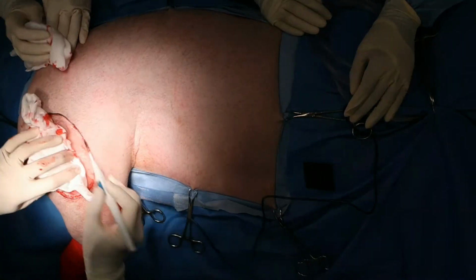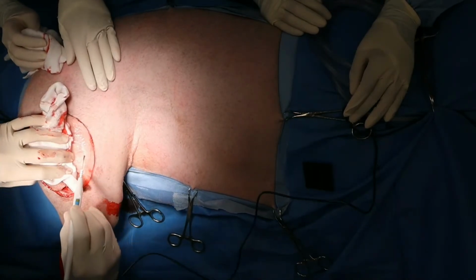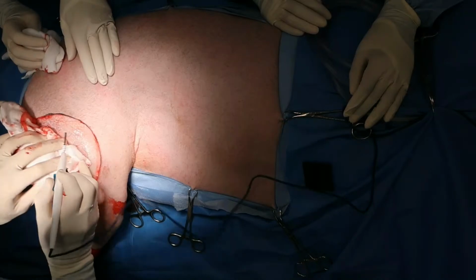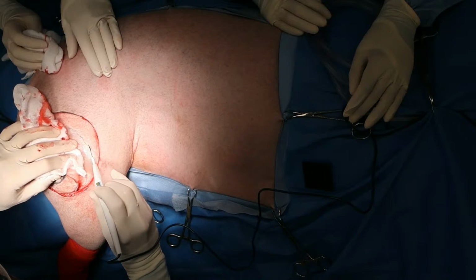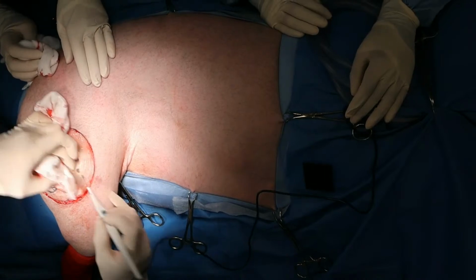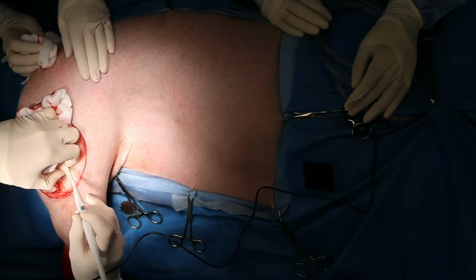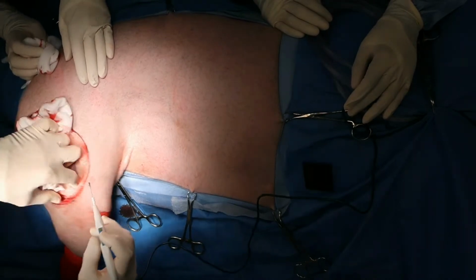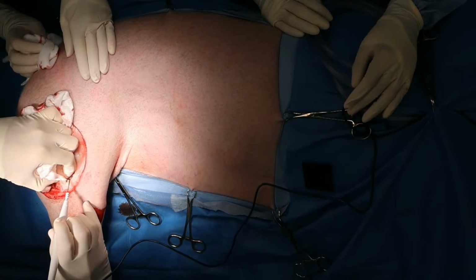All right, so I'm just going to put some tension. I find that when you're using electric cautery to cut through tissue, keeping it under a little bit of tension really helps those tissue layers to separate. So I'm going through, so that's fascia lata right there, okay? And underneath that is going to be vastus lateralis. And then the fascia lata combines with the superficial biceps muscle fascia.